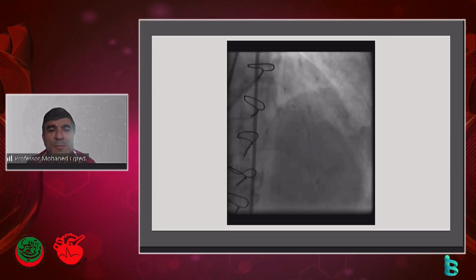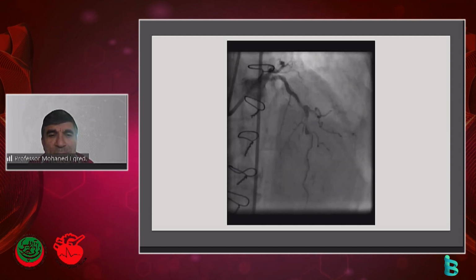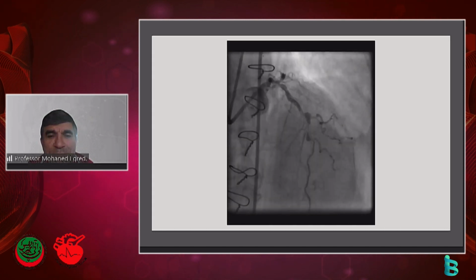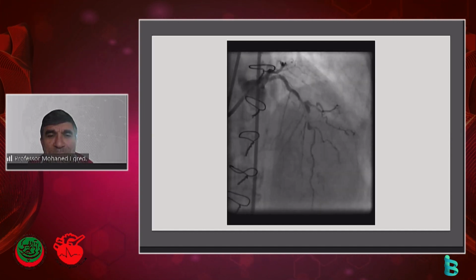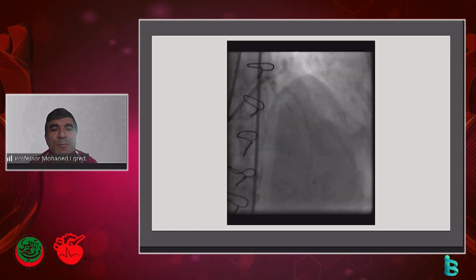For that, probably you'll end up doing some litho or something like that, because of those angles and the hardware available to you. Probably that is the safer way, because these angles are not very good as far as rotational atherectomy, which is our baby over here, is the thing to be used. And once you have your volumes well established, then probably you will consider coming back. That's my take on it.